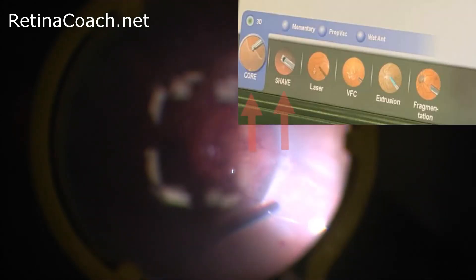This allows a good shave of the vitreous without tearing the retina. Depending on the vitrectomy system and the preferences of the surgeon, settings for shaving and core vitrectomy can be programmed separately in advance or set manually during the surgery.